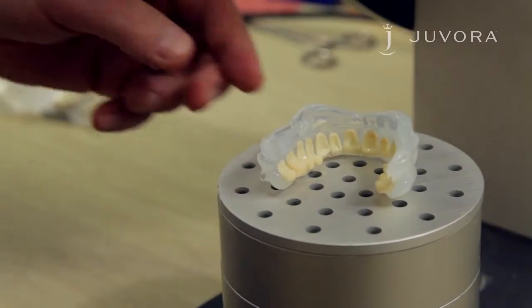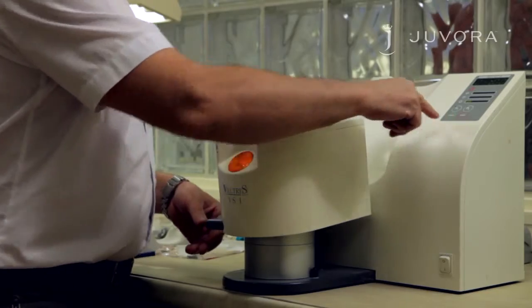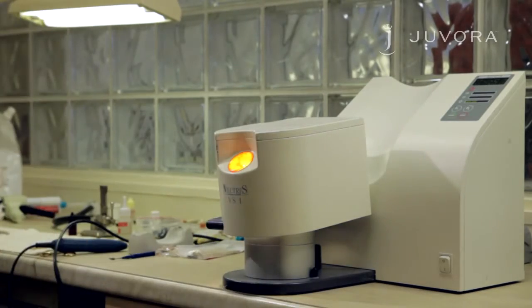Place in a light curing unit for 3 minutes. After 3 minutes, the inhibition layer will appear. This layer is important for the bonding of the composite.